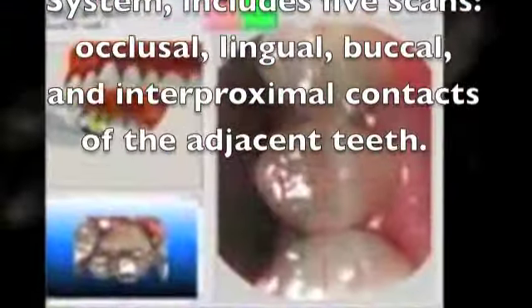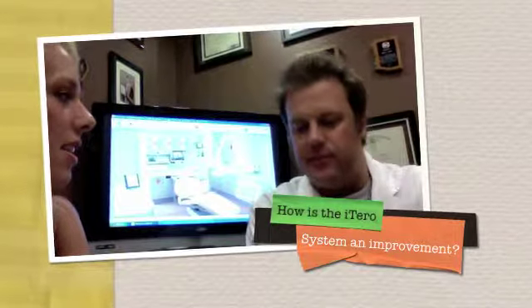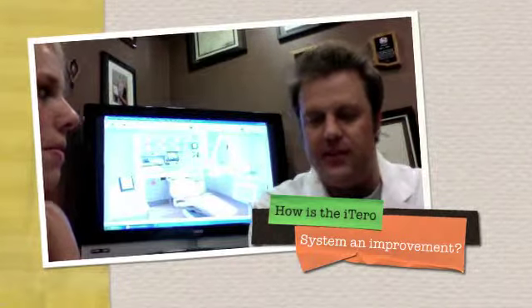What do you as a dentist like about the iTero system in comparison to, for example, the old process? It's more precise than the old process.